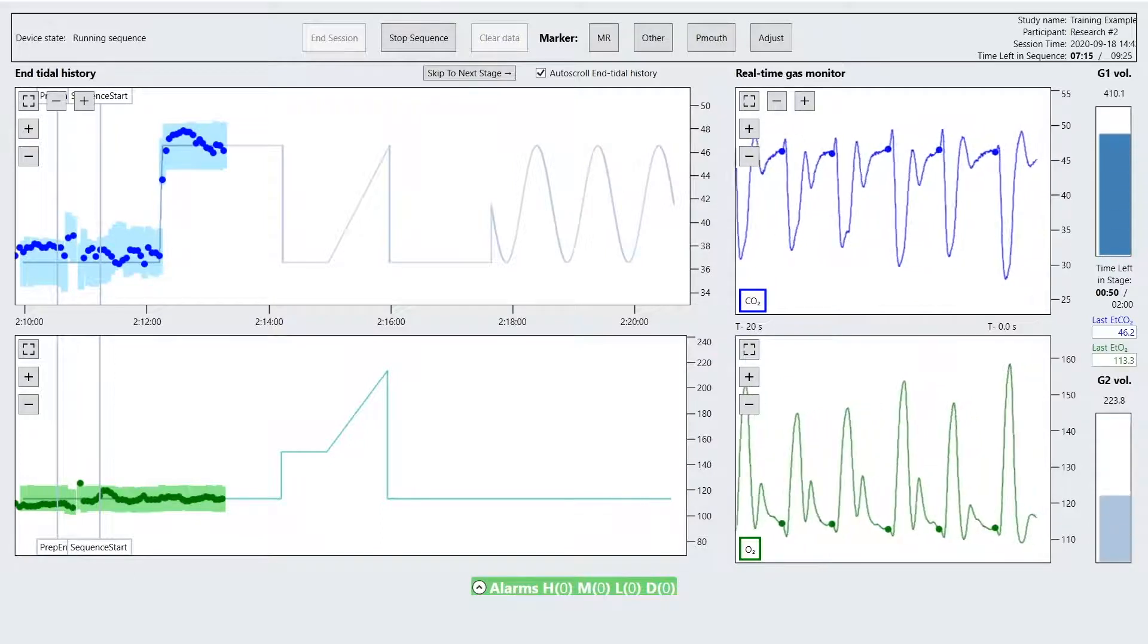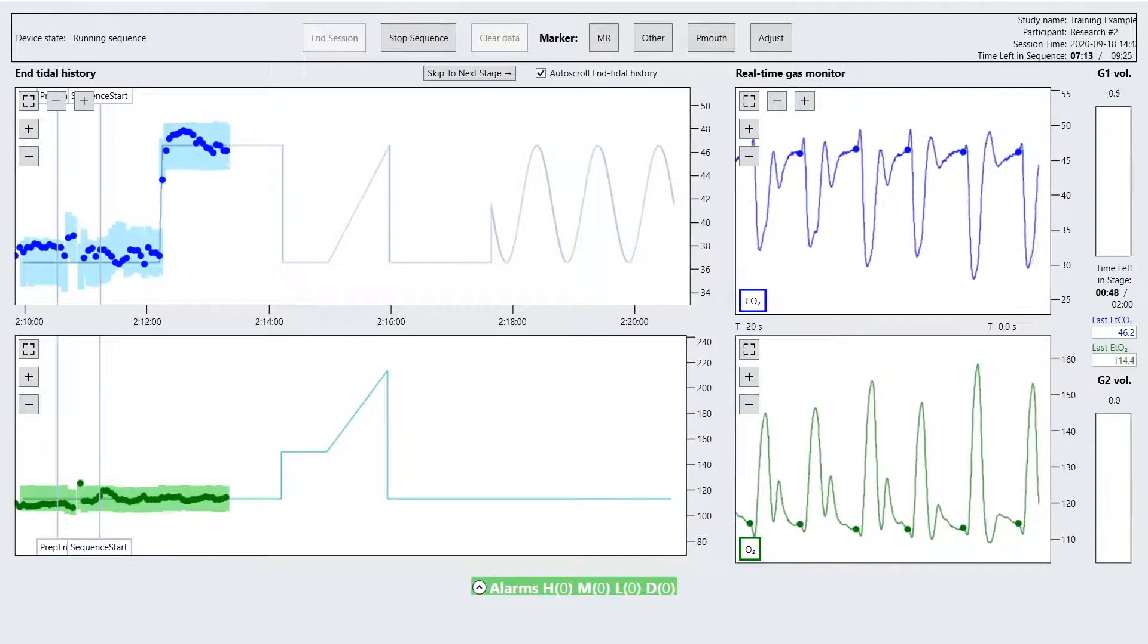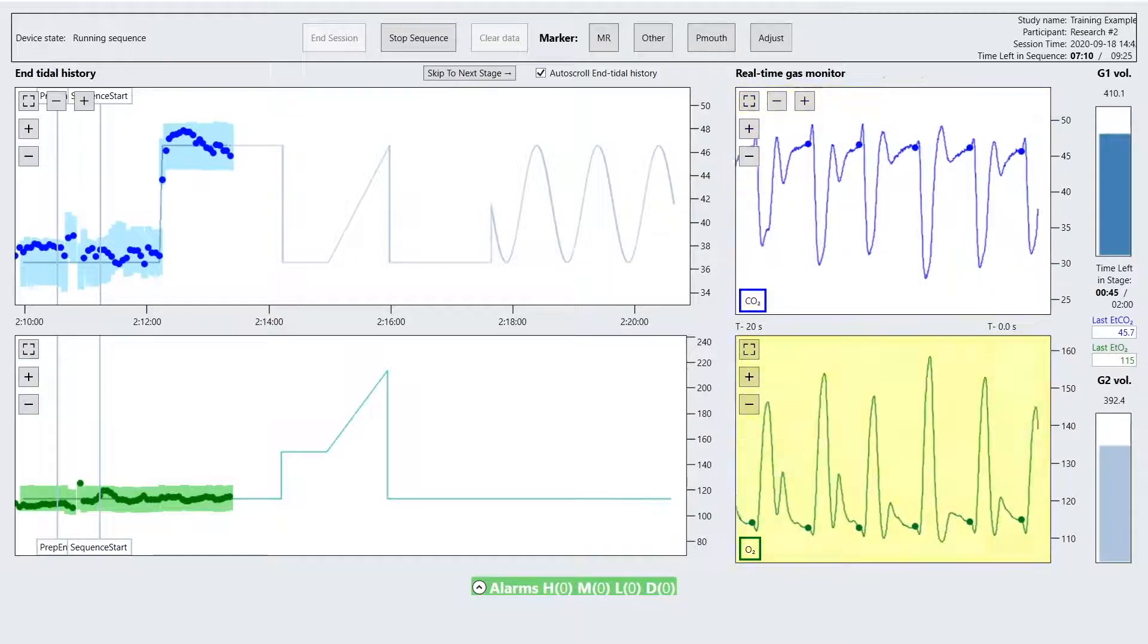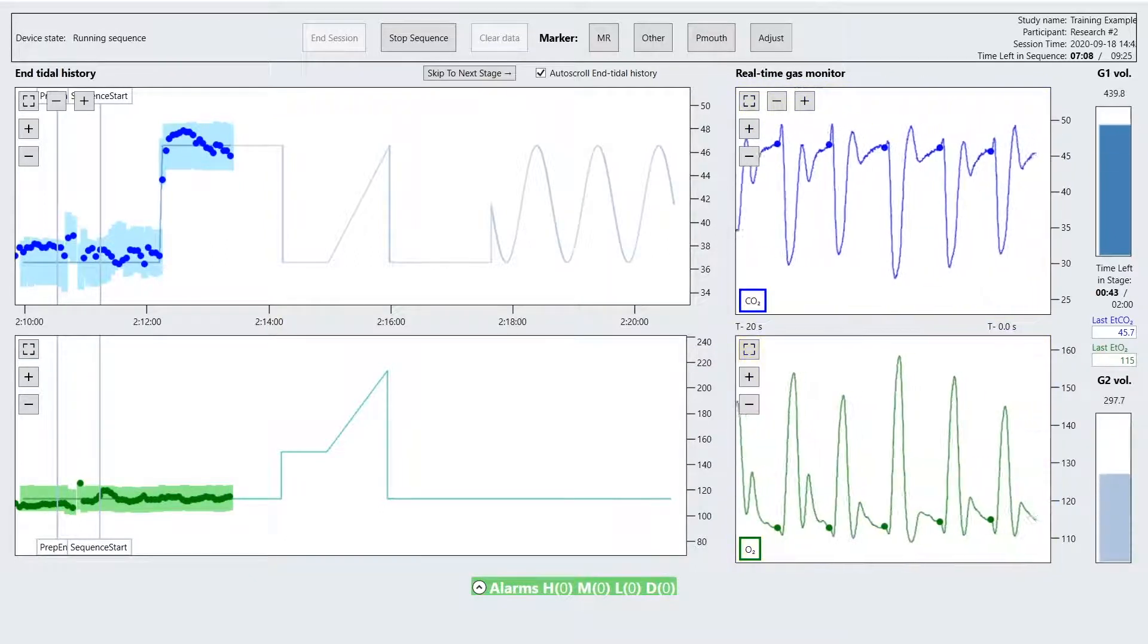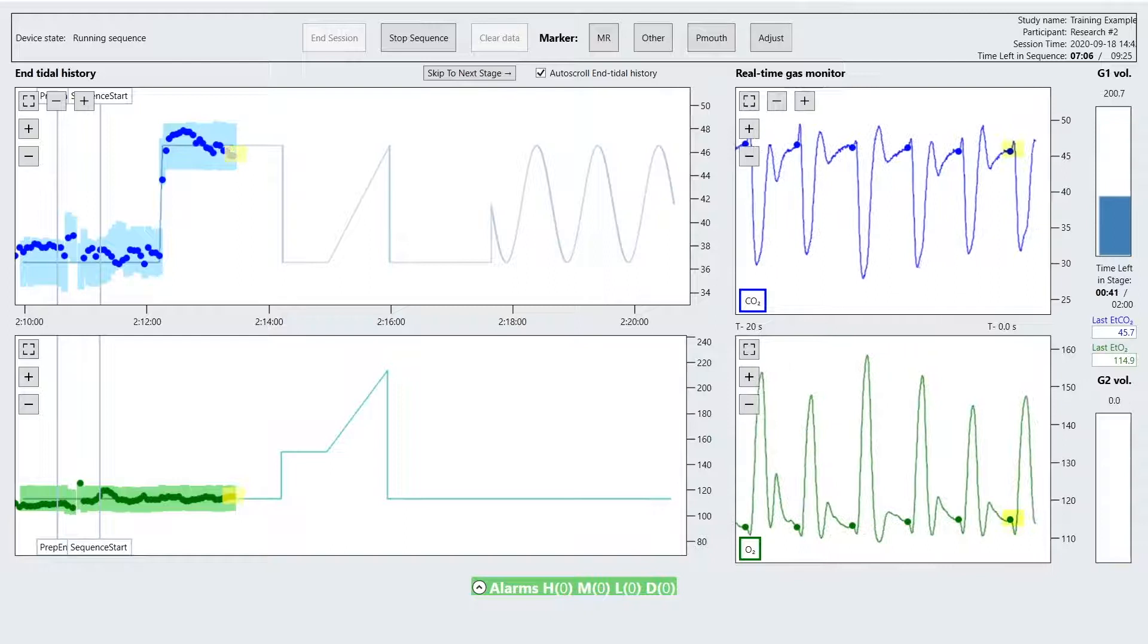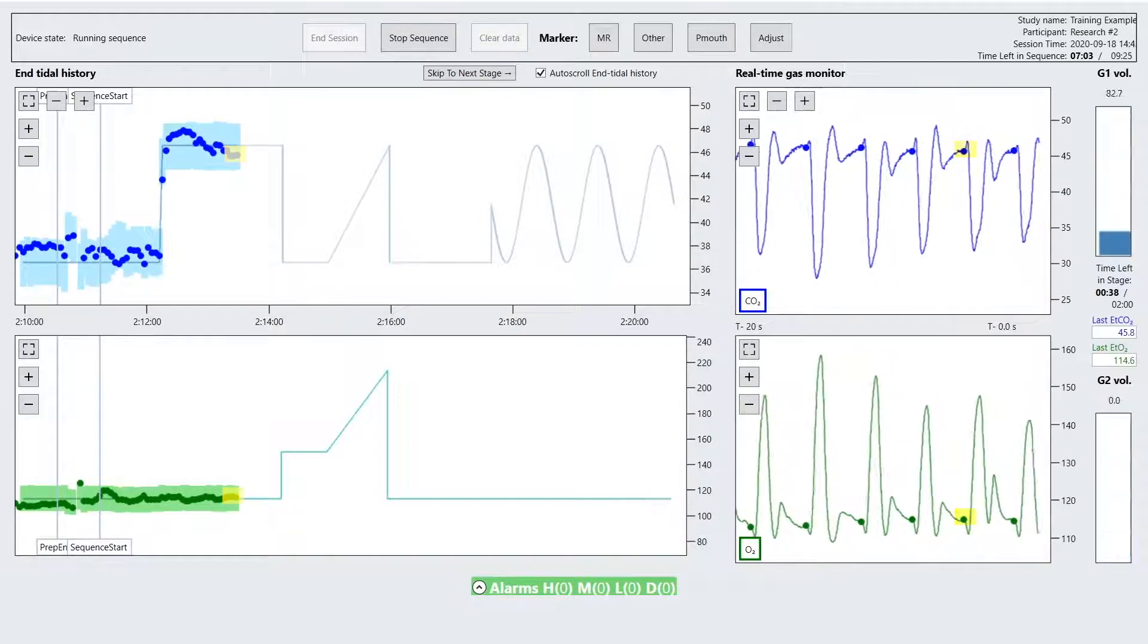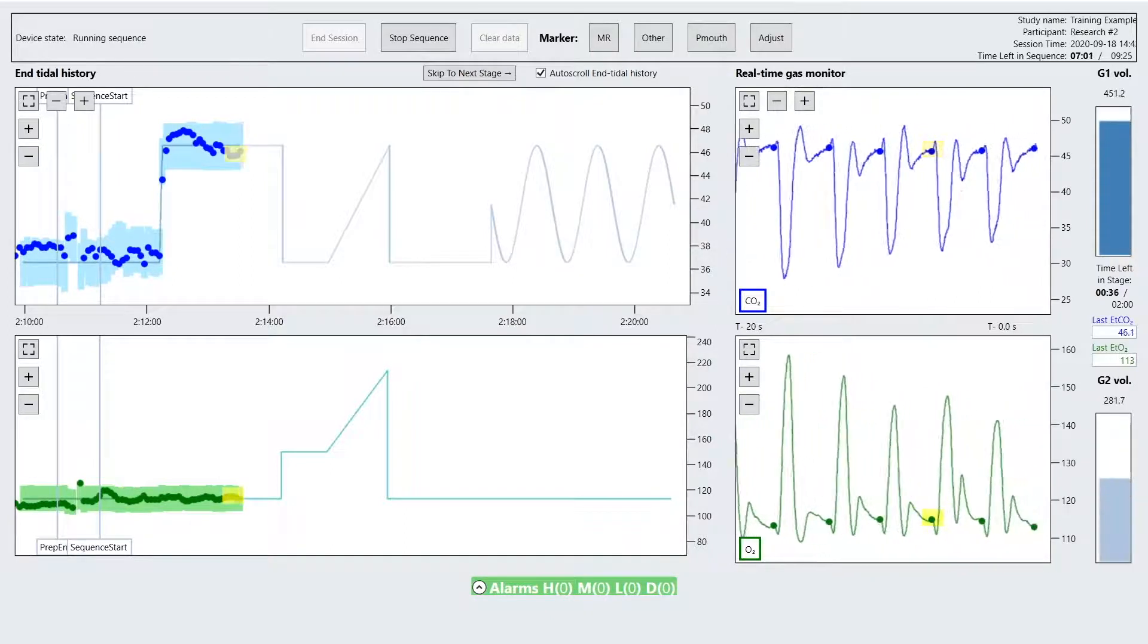The real-time pCO2 and pO2 graphs display a continuous tracing of pCO2 in blue and pO2 in green, as measured at the mouth in millimeters mercury. The dots on the pO2 and pCO2 tracings show the end-tidal values for each breath.